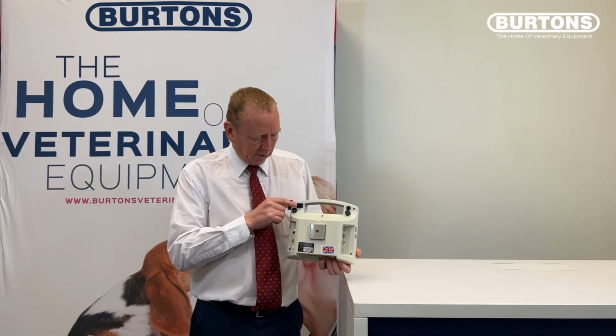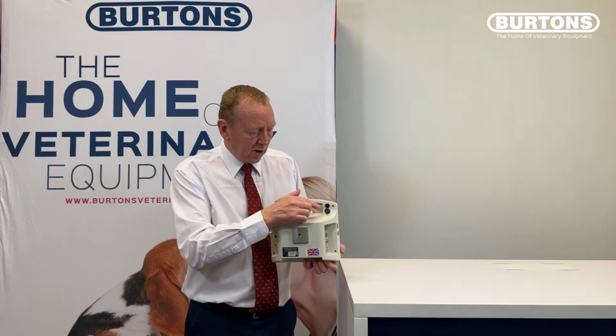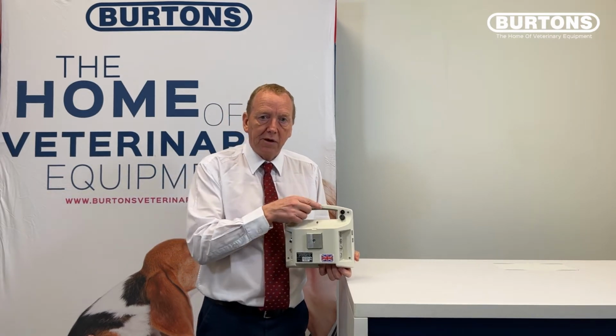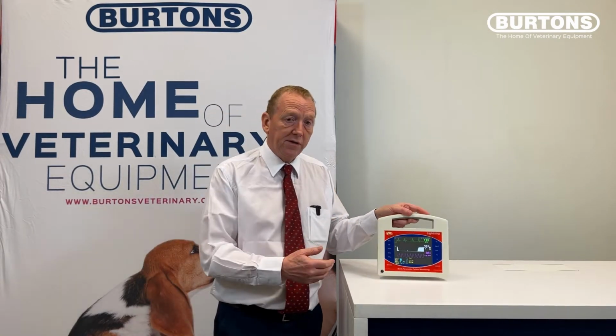Also on the back, we have our on-off switch, our volume control for alarms and beeps, our power in for charging, and the unit can be run and charged at the same time, and our fuse. Patient connections are made on either side of the unit.